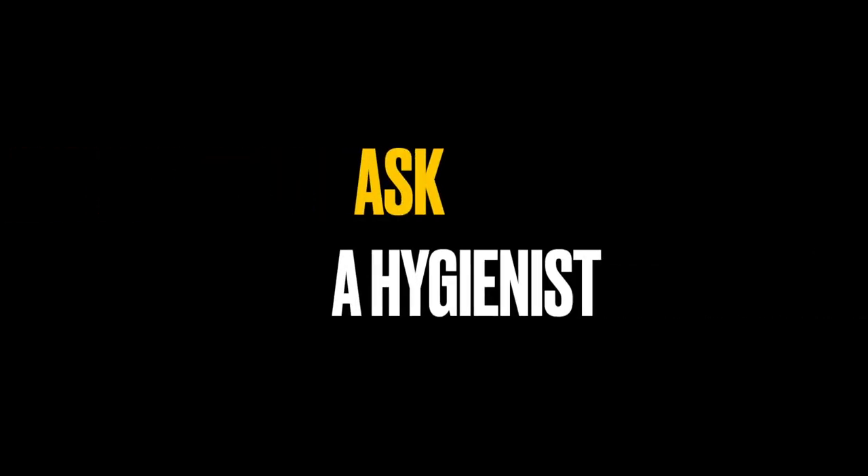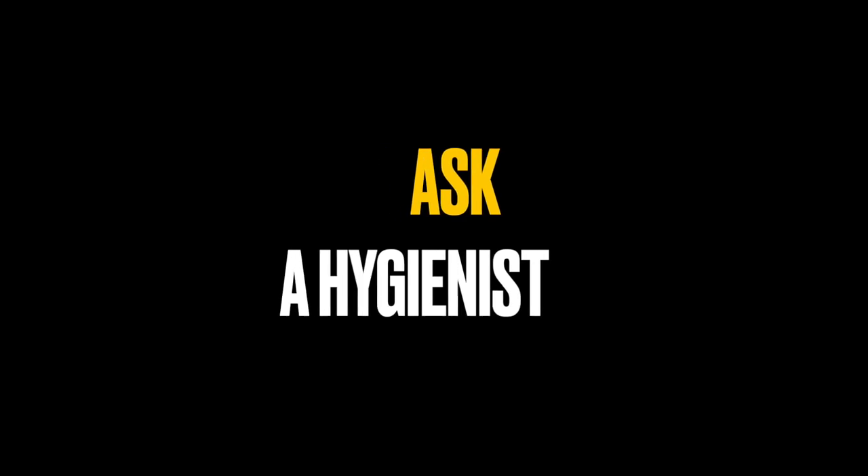This is the Apex Electric Toothbrush made by Fozu, and it has a feature in it that I've never seen before in an electric toothbrush. Hey guys, if you're new here, I'm Christina the hygienist, here today with another dental product review. Today's product, as I just mentioned, is the Apex Electric Toothbrush.